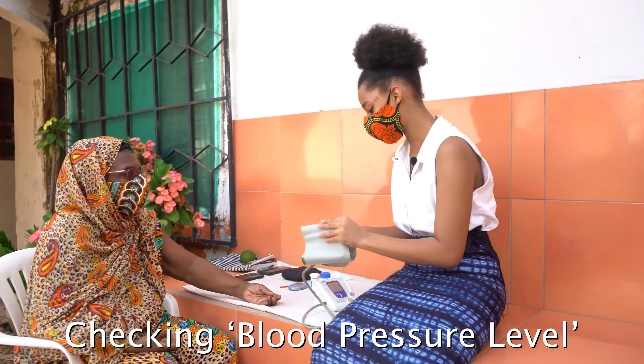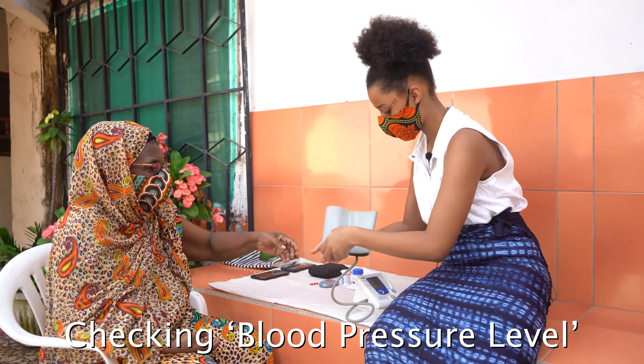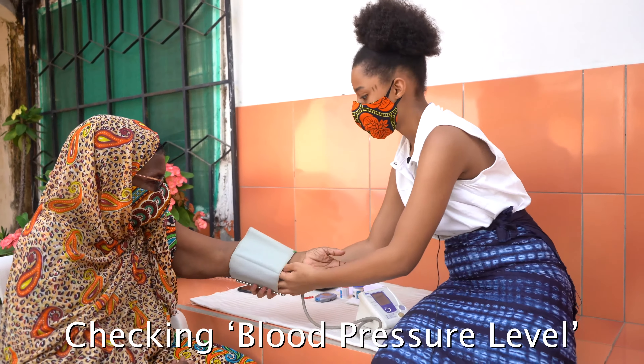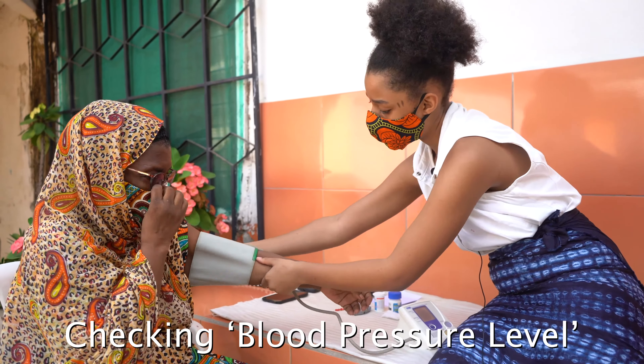So first we're going to be starting with her blood pressure. This is the easier part of it.